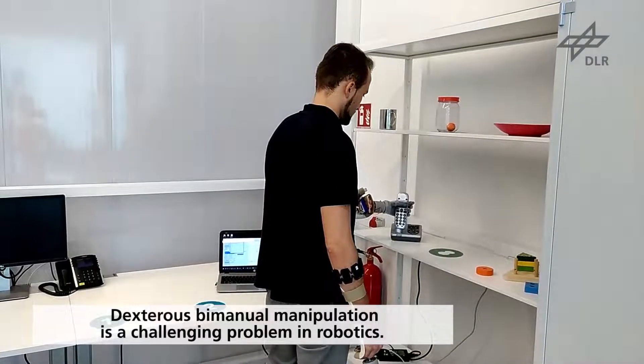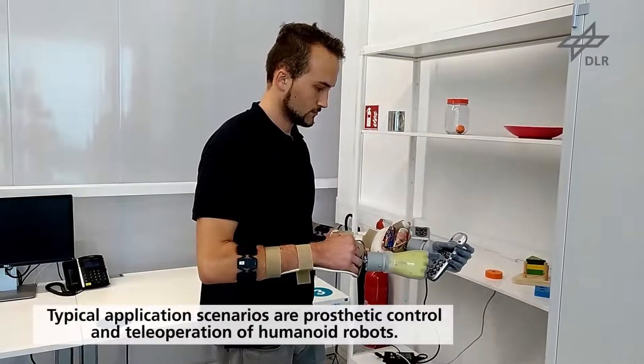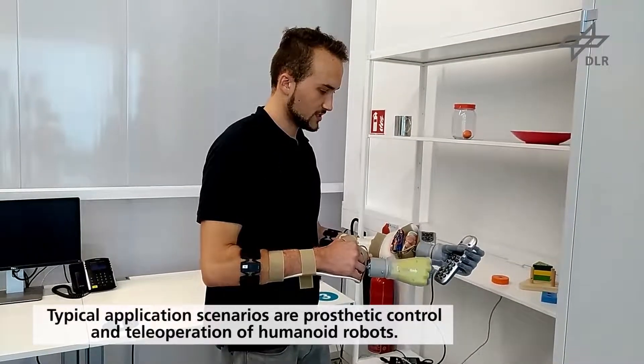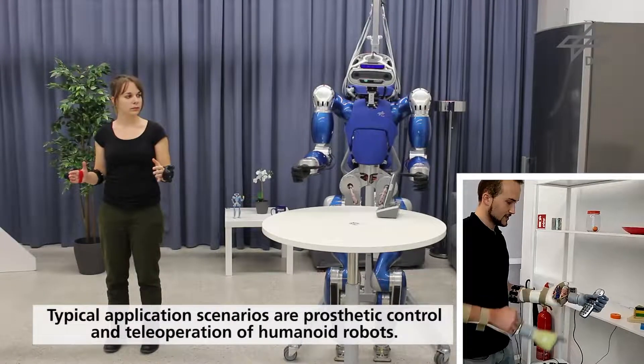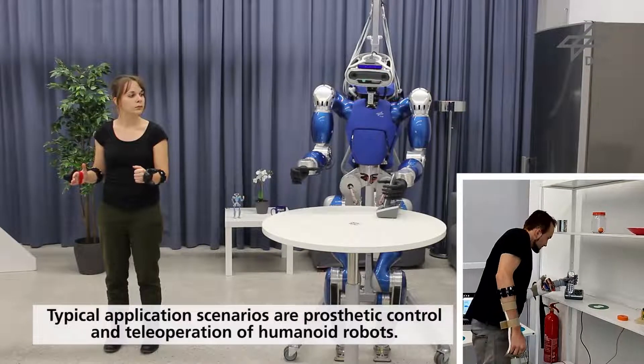Dexterous bimanual manipulation is a challenging problem in robotics. We have recently developed a bimanual setup with two commercial hand prostheses mounted on splints and controlled via surface electromyography, allowing human subjects to perform dexterous manipulation in controlled conditions.